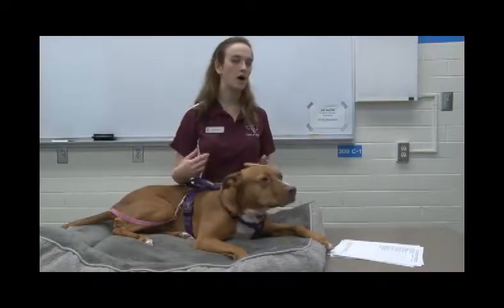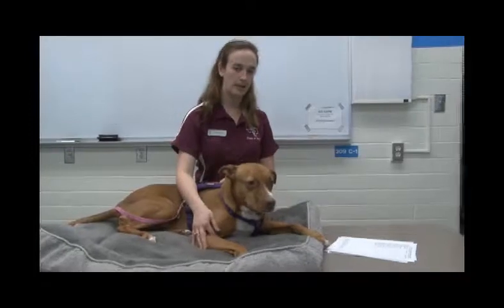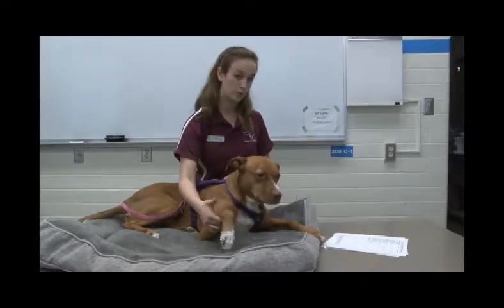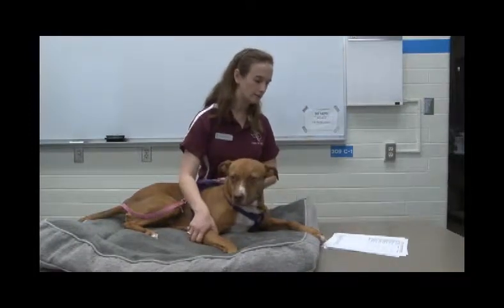You're going to stand on the side opposite of the leg that you're putting the catheter in. In this case the veterinarian would be going for her right leg, so I'm on her left side.